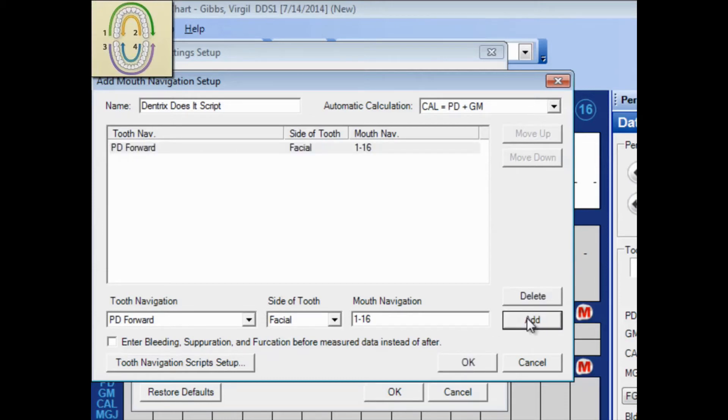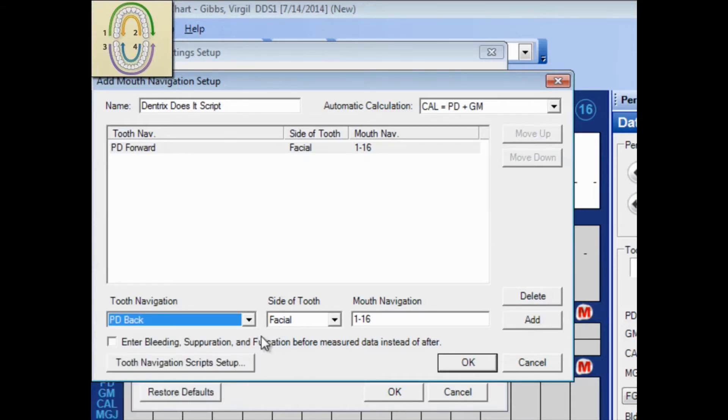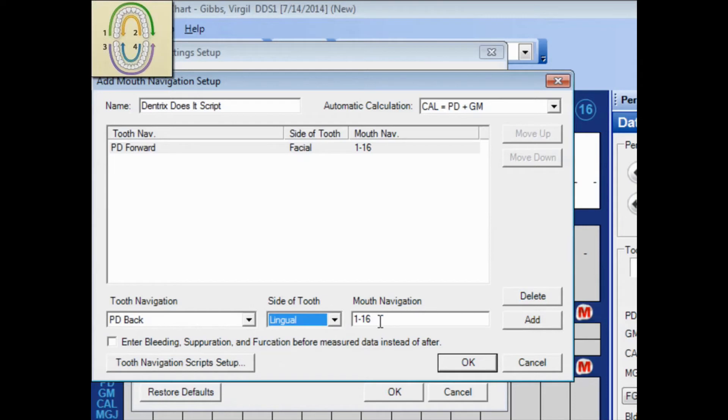The second line of my script is a backward motion from right to left. It's checking the lingual side of the mouth. And it is moving from 16 to 1. And click Add.